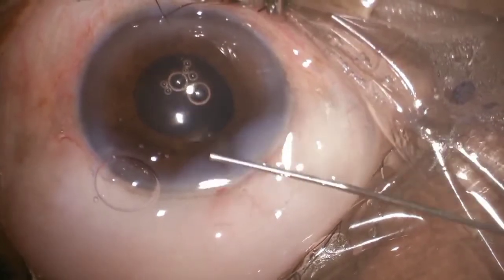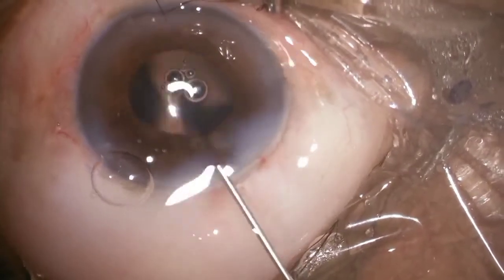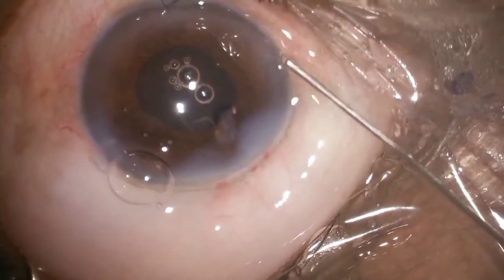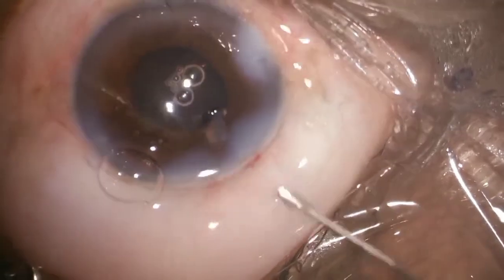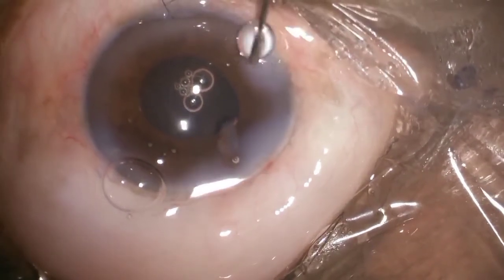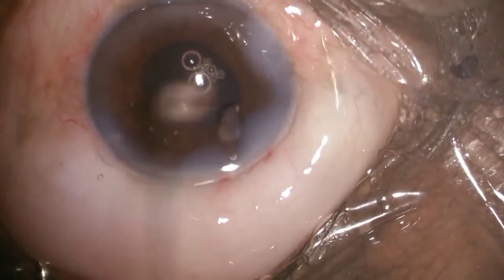And after sealing the main wound, I sealed the side ports, first one side port, then the second side port.